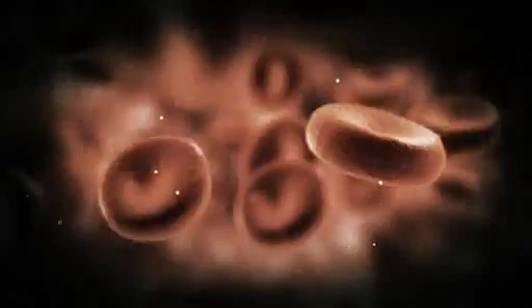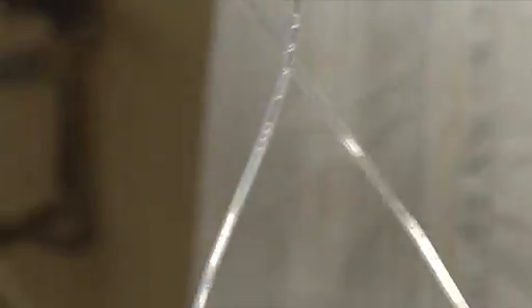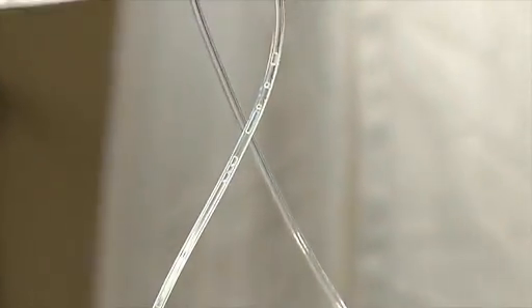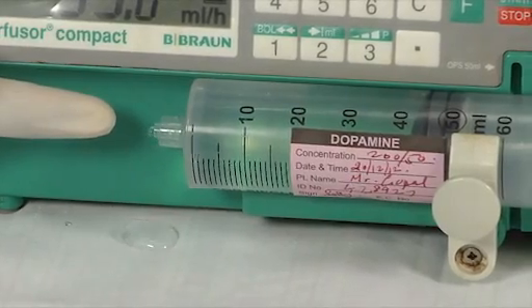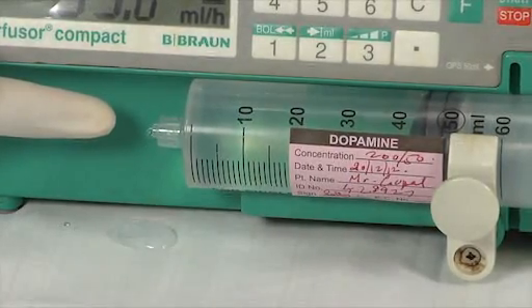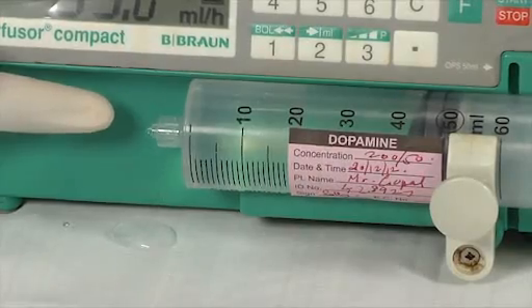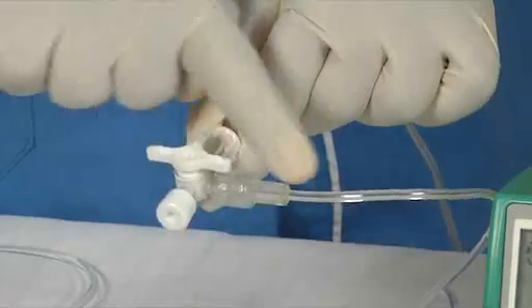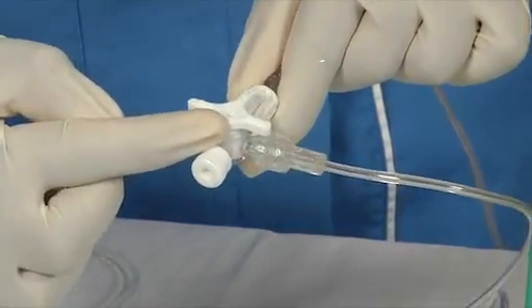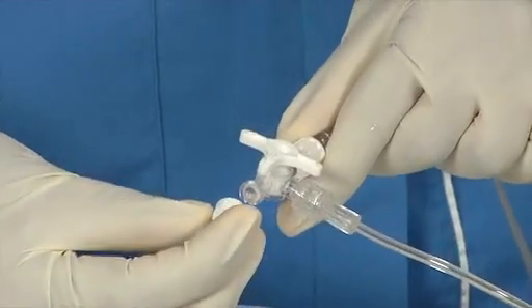Loose connection. Whenever there is any loose connection in any of the tube connectors or the three-way stopcock, leakages may occur and some air might enter. This could be dangerous for the patient. Always take care to make sure the connections are properly engaged and the outlet caps are tightly closed. In this case, the outlet cap of the three-way stopcock needed to be tightened.